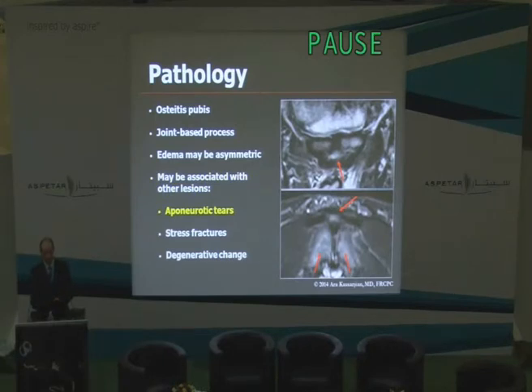that I showed you. Here's a case, 2 different patients where you can see edema on both sides of the symphysis pubis. So this is theoretically osteitis pubis, but if you look more closely, you see this midline plate injury. And I think that's very important to make that distinction.